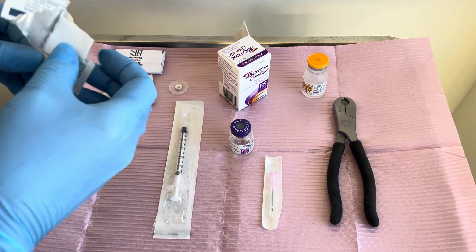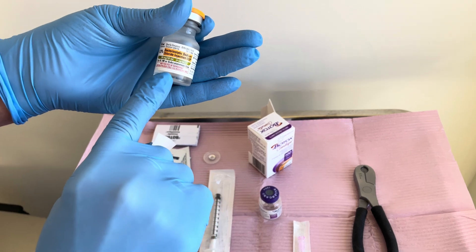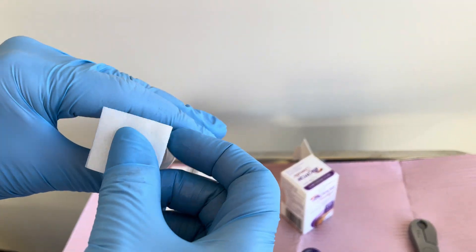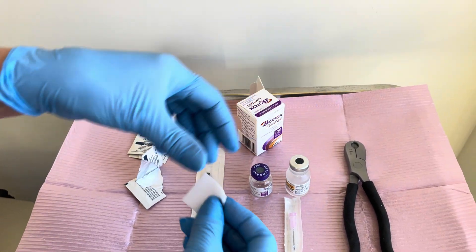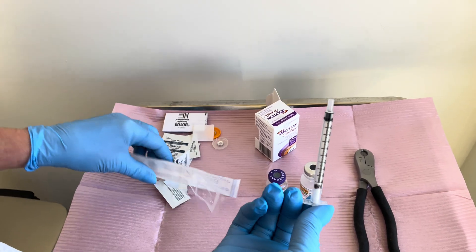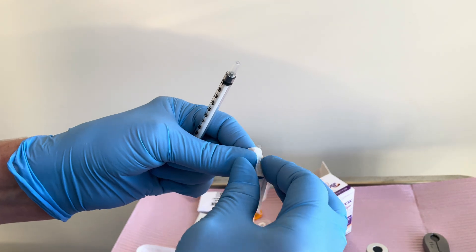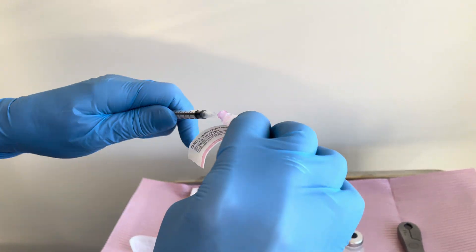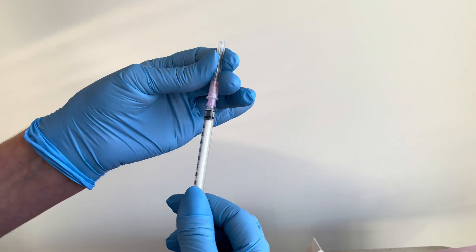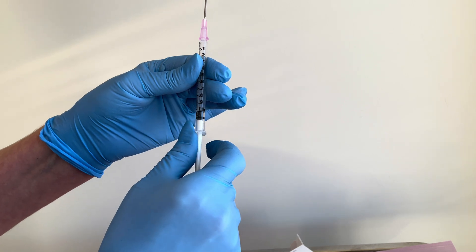You're going to wipe off the cap with an alcohol wipe. We use bacteriostatic saline — wash off the top of that vial with your alcohol wipe as well. I'm going to use a 1cc tuberculin syringe and an 18-gauge needle to mix it up. You want to use just one needle every time; once you're finished mixing up a vial of neurotoxin, you're going to discard your needle.